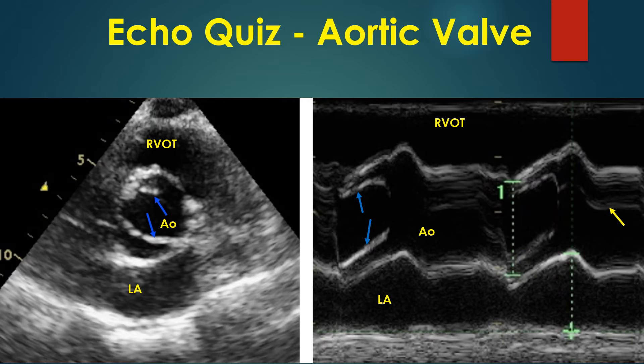Opening is incomplete, though there is a good orifice. The M-Mode image shows an M-Mode cut at the aorta-left atrium level. Right ventricular outflow tract is seen anteriorly and left atrium posteriorly. Aortic valve and aortic valve motions are seen between the two.